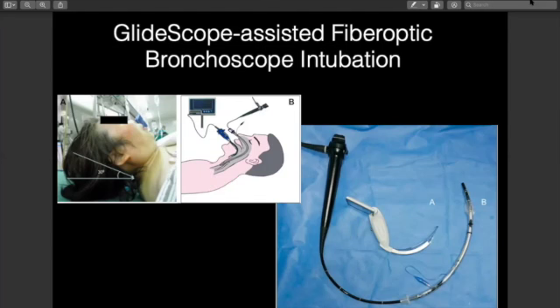So if you have the carina in view, your endotracheal tube is in, you'll accomplish 2 things. You won't accidentally pull your scope out, and you won't accidentally be endobronchial. So your tube comes off of the fiberscope. Do you push propofol? Not yet.